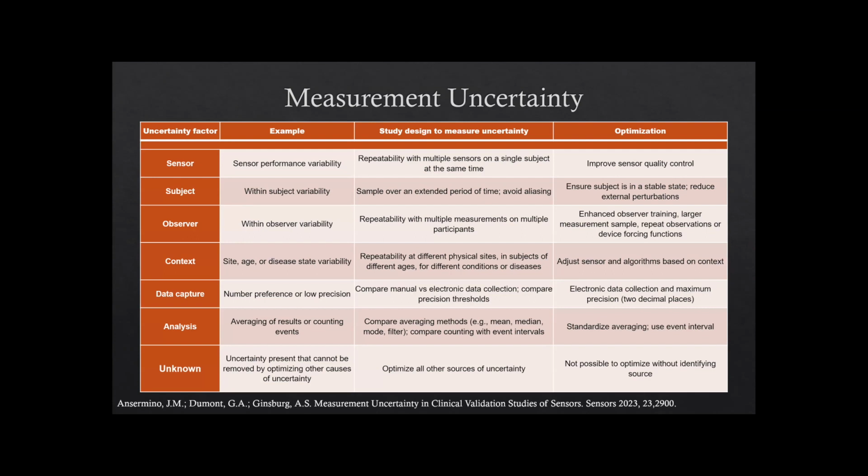But when we start talking about this uncertainty, when we're designing a device, we kind of lump all of this together. Certainly this was happening in the studies I was seeing: we lumped all the uncertainty together, put all of that blame on the sensor, and said these devices were not performing well enough. But in actual fact, this uncertainty happens for many other reasons. And we've heard a lot about that today. The other speakers have really addressed this.